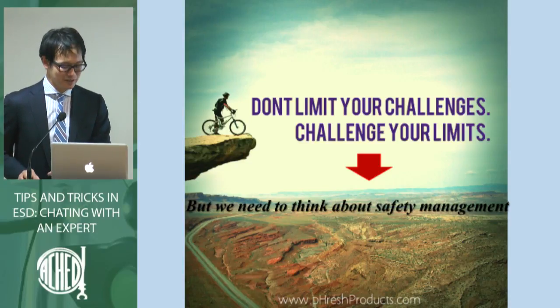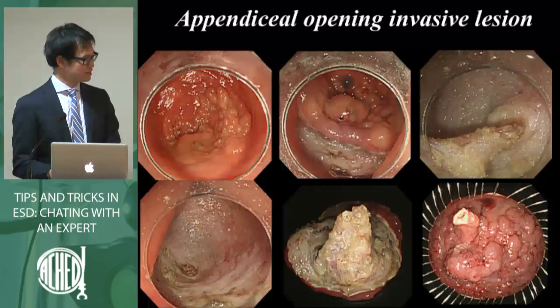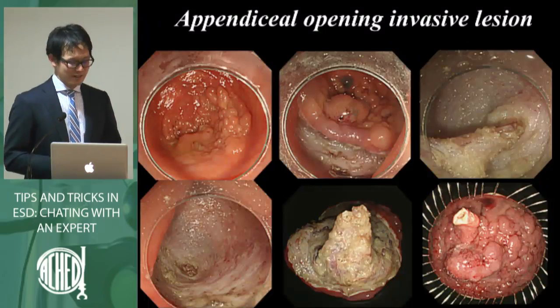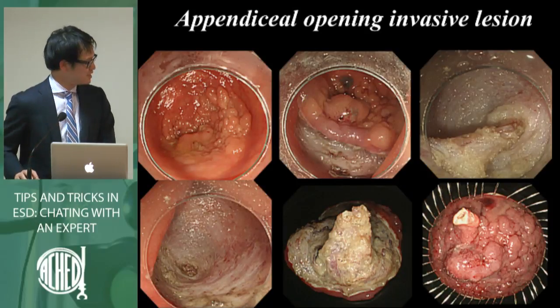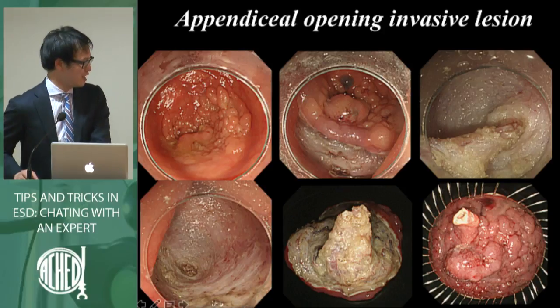The procedure needs to run under an expert. So it is important. This is a very challenging case. Dr. Toyonaga performed the ESD procedure. This is the appendix orifice. It was possible to resect the appendix area almost completely.